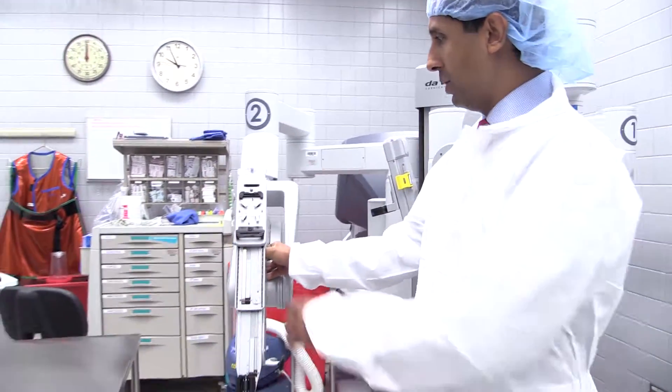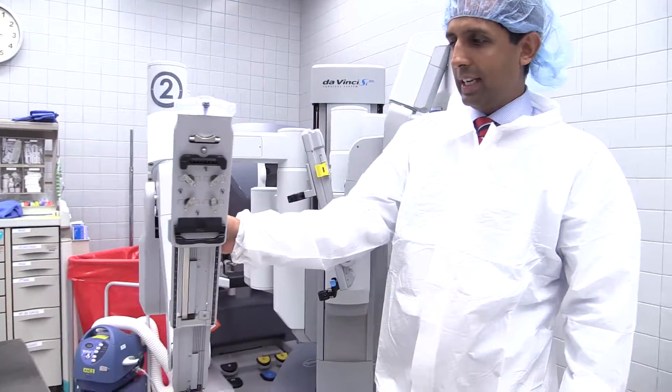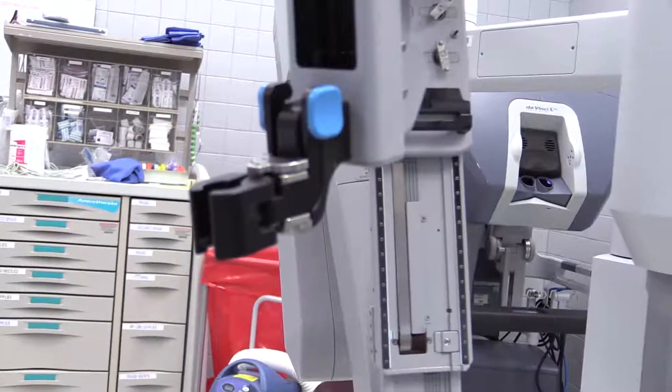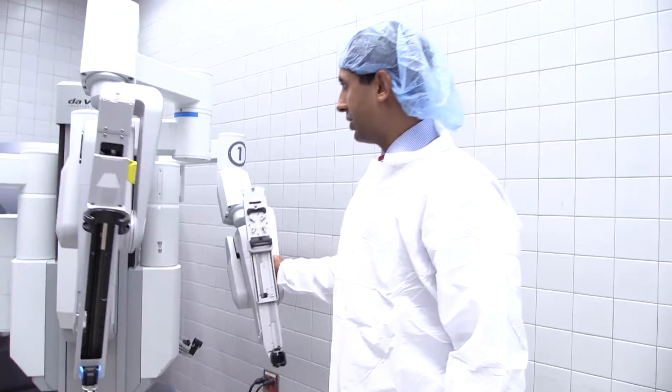So this is how the arms move, and these arms are brought right to the patient, and then the surgeon can move the arms around like that. This is another arm. This is where the camera goes — we have a 3D camera that's placed here, and then this is the second arm.